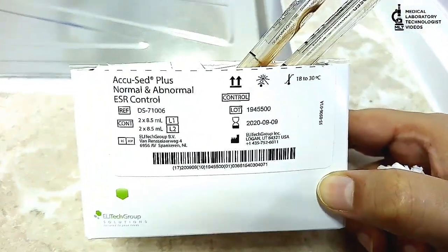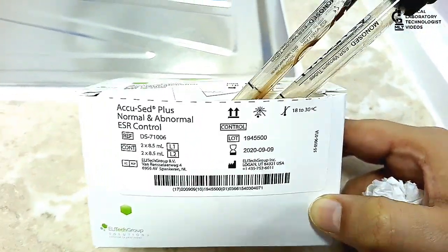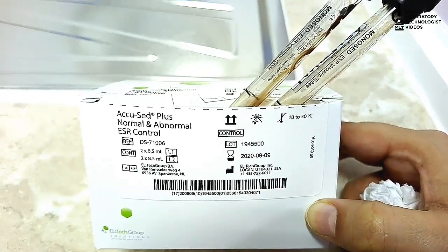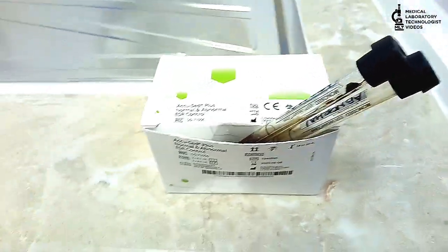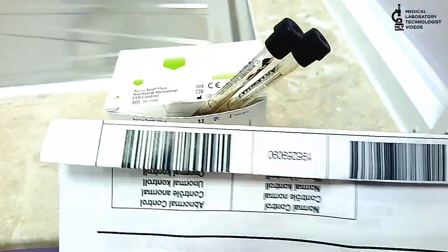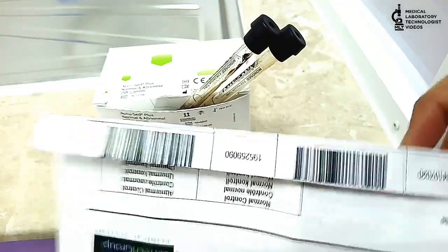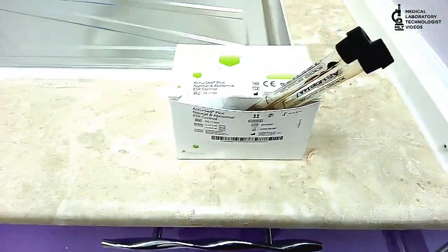There is normal and abnormal control. I already filled the control because daily you don't need to make new control. This control you can use for several days.